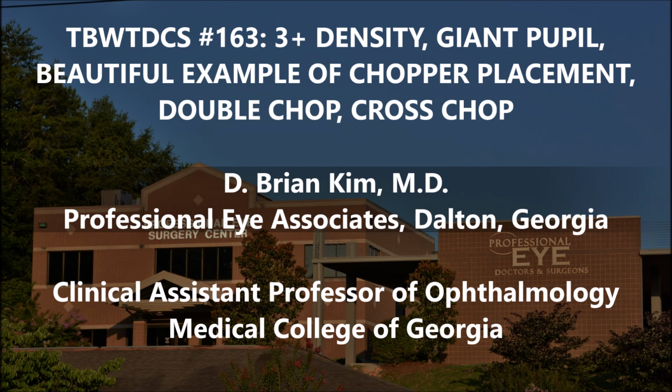By doing it this way, I am not handcuffed by having to use high vacuum and ultrasonic energy to grab pieces. I'm able to use a chopper to pull lens pieces up out of the bag. And again, sandwiching the lens pieces and leveraging mechanical forces to disassemble the lens safely and efficiently.